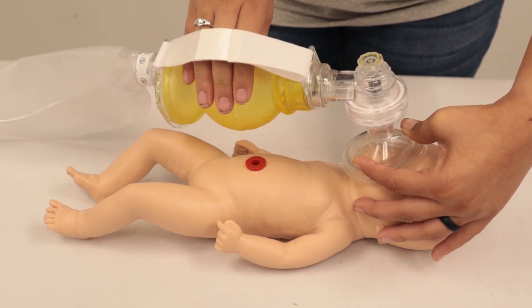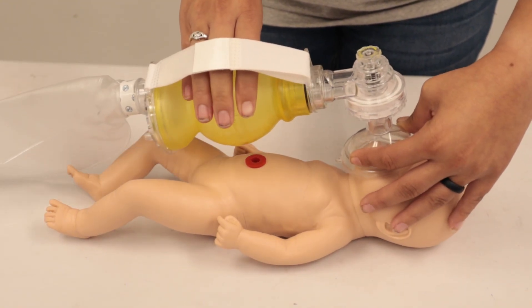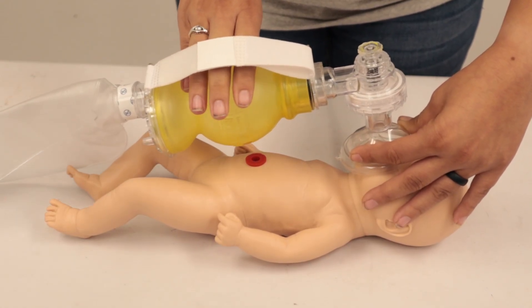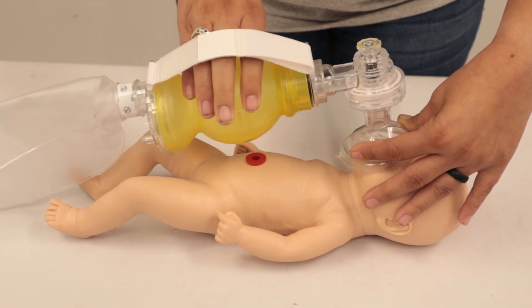If available, we're going to attach an O2 saturation monitor and a 3-lead monitor for obtaining a heart rate while we're doing these ventilations. We're also going to attach O2 from your oxygen tank if you have that capability.